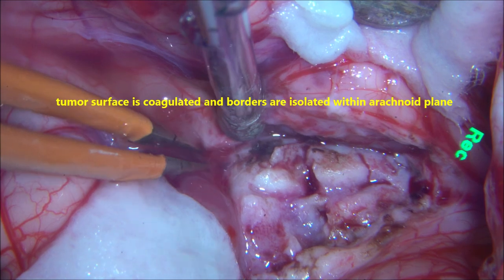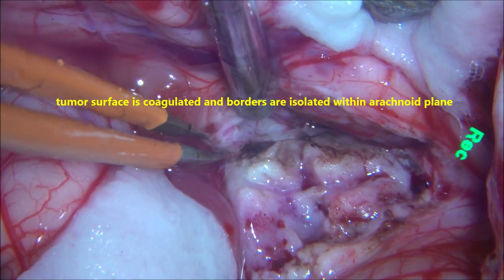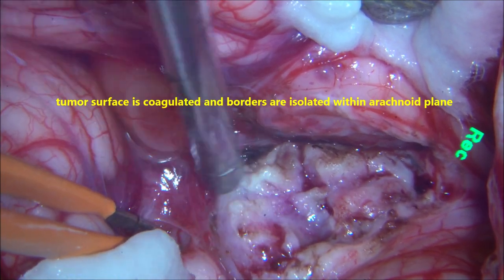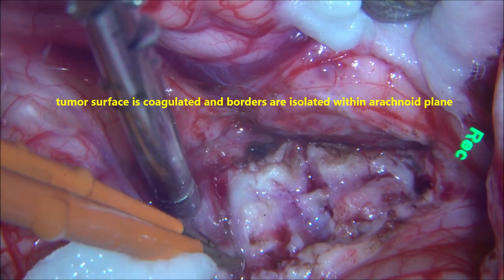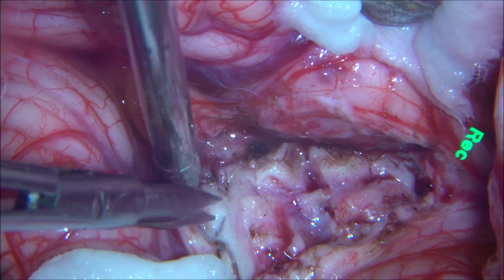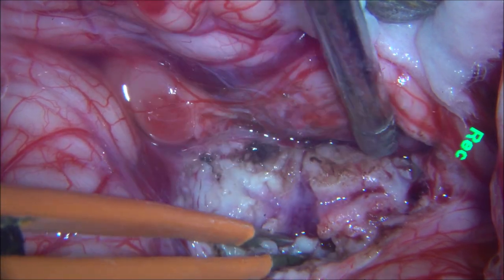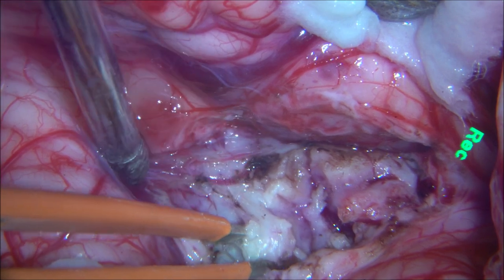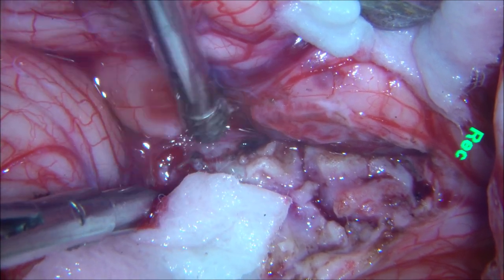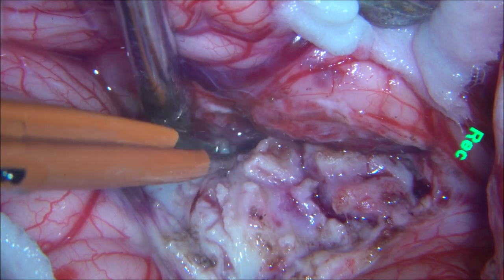We then go to the periphery and superior surface of the tumour. The arachnoid is opened, and again the surface of the tumour is coagulated and vascularity is reduced. That is the lateral part of the tumour going into the cerebellar hemisphere on the lateral side. A plane of cleavage is created between the tumour and the cerebellum. The surface is coagulated, devascularisation is reduced, and you can see the tumour is quite firm and vascular.